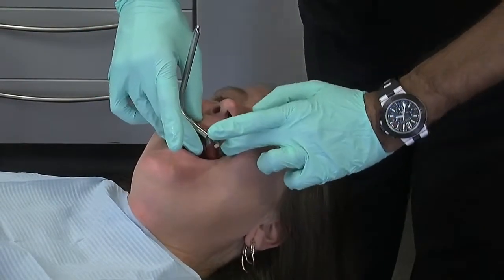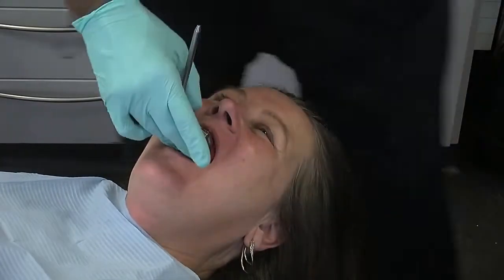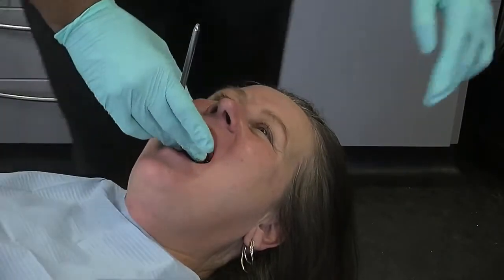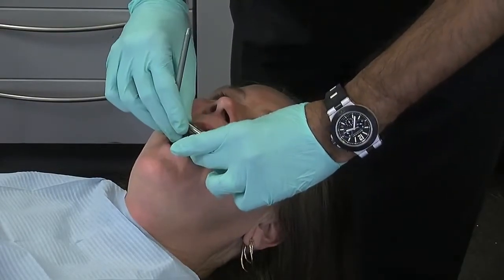Just keep that there for a short while. Checking one more time to make sure that's correct, which it is. And then we just chill this in some cold water.